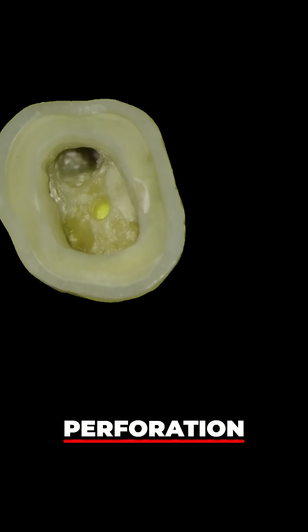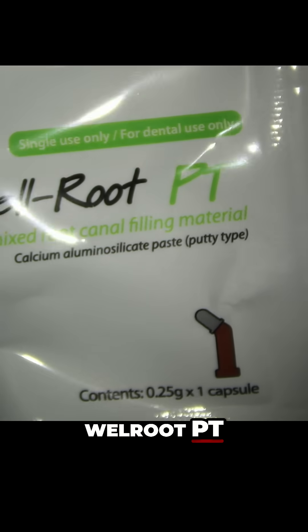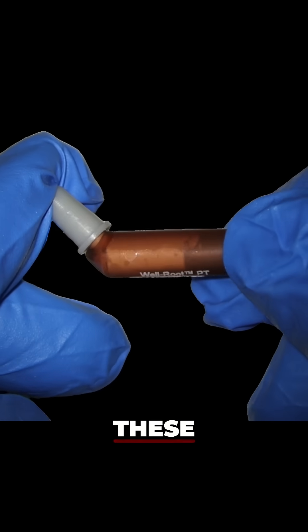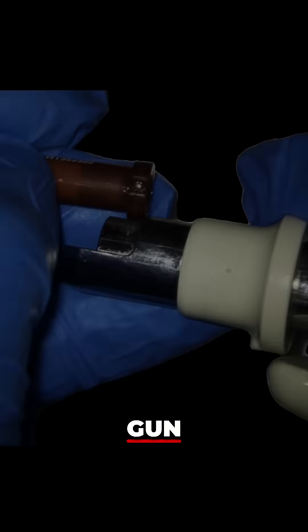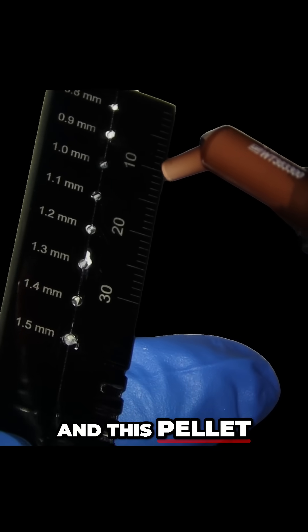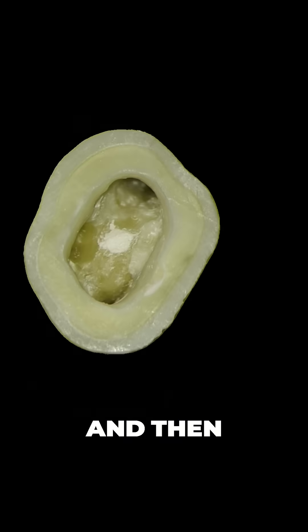You can see here we've got a perforation in the access cavity floor. The great thing about this Wellroot PT bioceramic putty is that it comes pre-mixed in compule-like capsules that can be placed into a comp gun. We can then decant this into our pellet former, which is going to make a fixed diameter sized pellet.